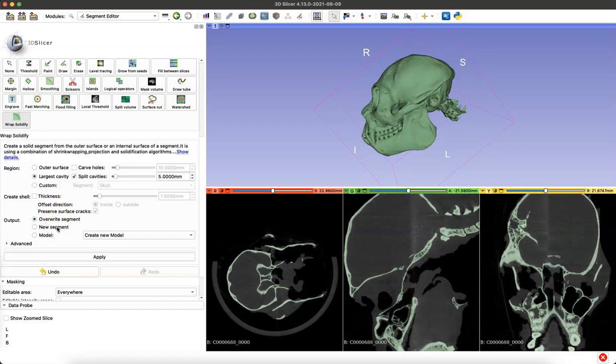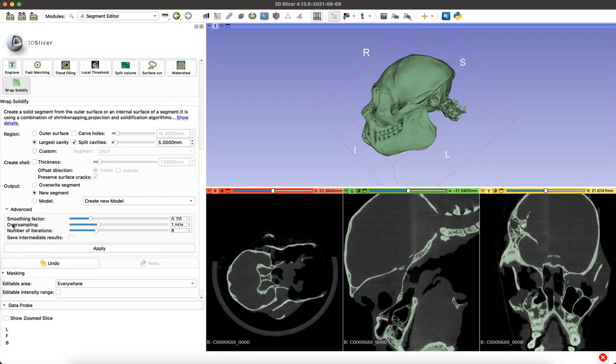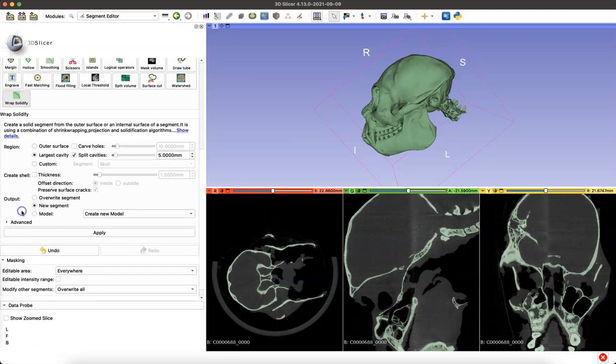You don't want to overwrite the skull segment we just created. You want to end up with two separate segments, the skull and the endocast. There are advanced settings, but for now we'll just close those and click Apply.